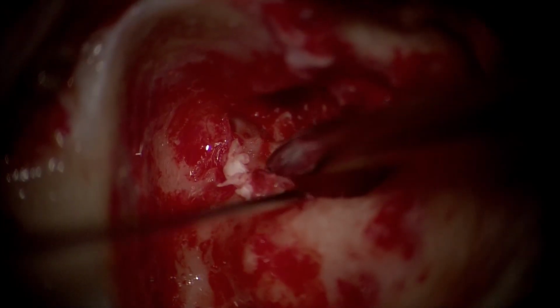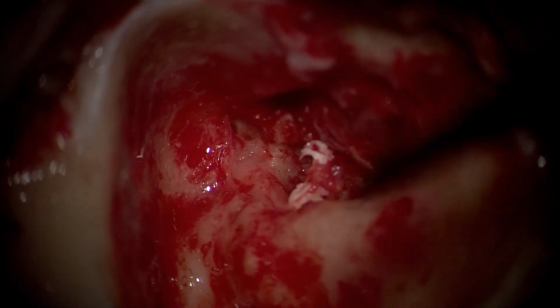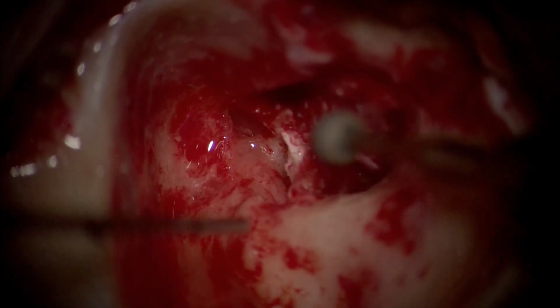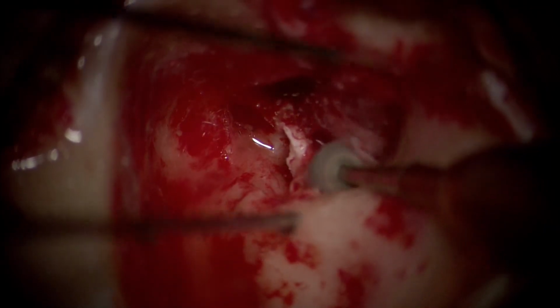We have seen a lot of times that despite adequate drilling experience, a lot of otologists who are in training or who are young are often very apprehensive about this step, and rightly so. There is reason to be apprehensive, but of course the point is to develop strong processes and techniques whereby disease from this region can be carefully addressed, thus avoiding residual cholesteatomas in this region.